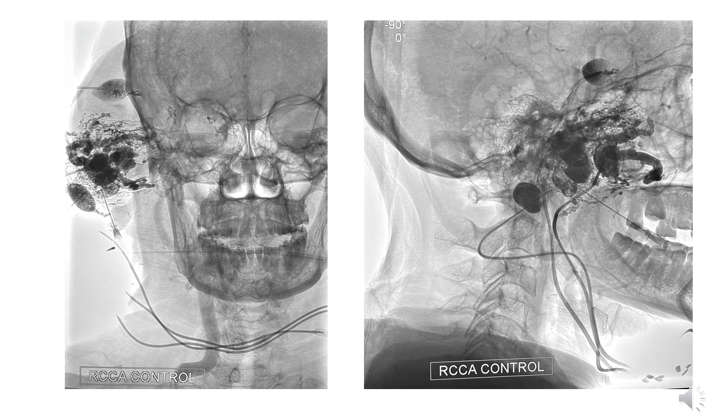Obviously I will remove all the needles once the procedure is done. One important thing to know is that all the needles are left behind until the end of the procedure. I'm not removing the needle after injection from them. It is just to prevent bleeding and complications. Also we know which areas we have punctured, which vessels we have punctured and such things. So to demarcate the embolized area where we have caused these vessel ruptures and all that stuff, it is important.